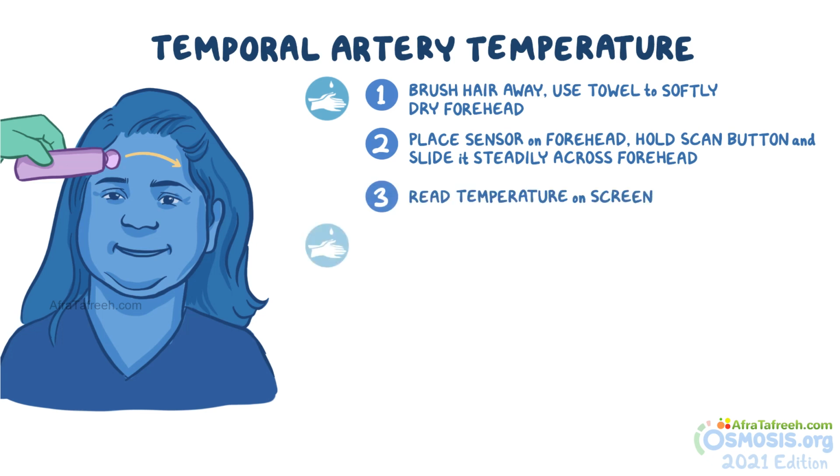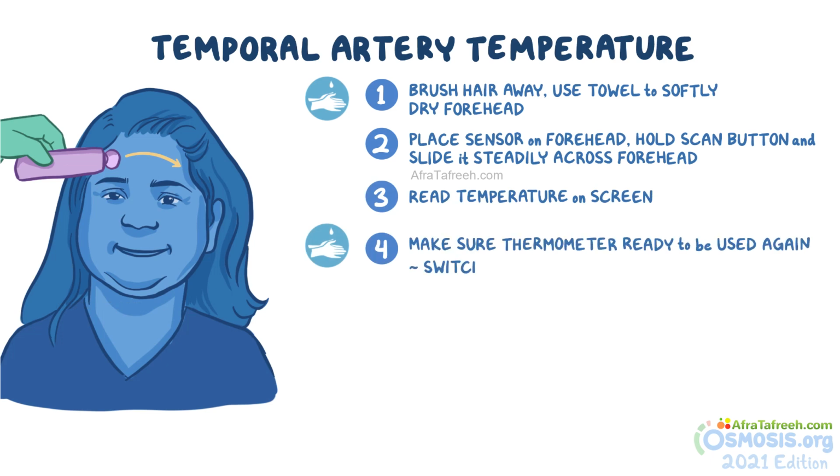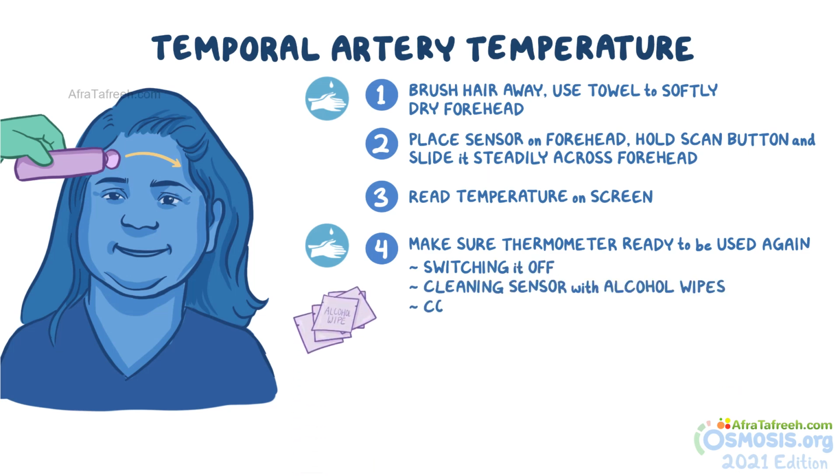Finally, practice hand hygiene and make sure the thermometer is ready to be used again by switching it off, cleaning the sensor with alcohol wipes, and connecting it back with its charger.